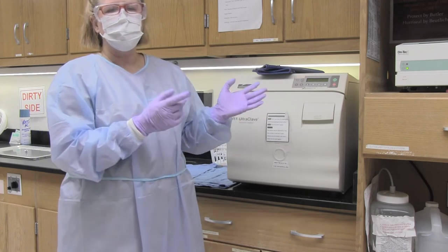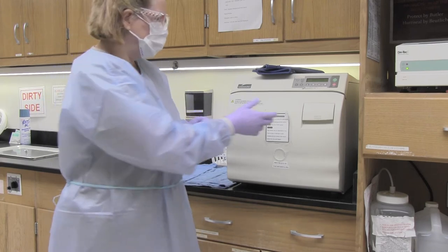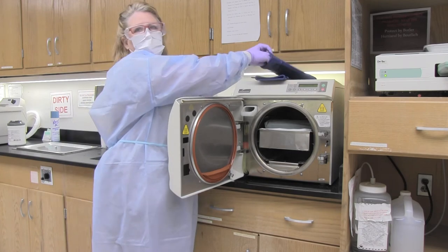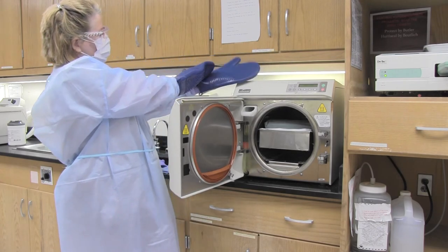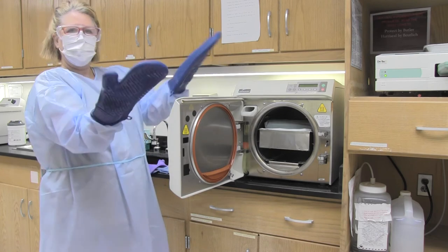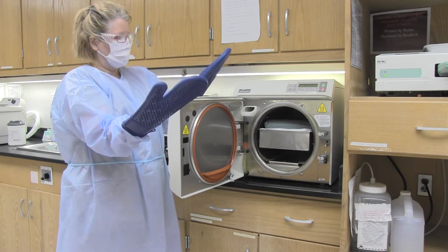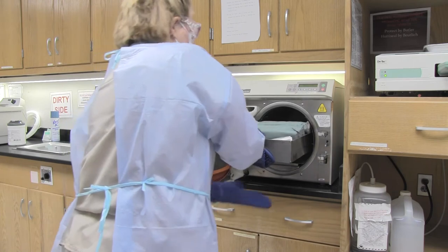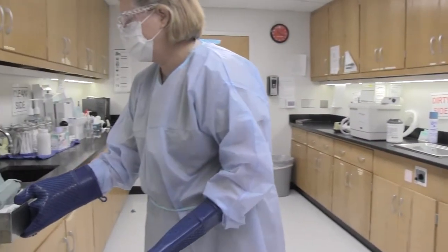Once the autoclave has completed its cycle, make sure it goes all the way through the dry cycle before opening the door and removing the instruments. When the door opens, you may remove the tray with oven mitts to the clean side in the sterilization room if the autoclave is needed immediately. If you have time, let the instruments dry in the autoclave until the display shows the dry cycle complete. These are our oven mitts — just like you would use at home. Take the tray out and place it on the clean side.